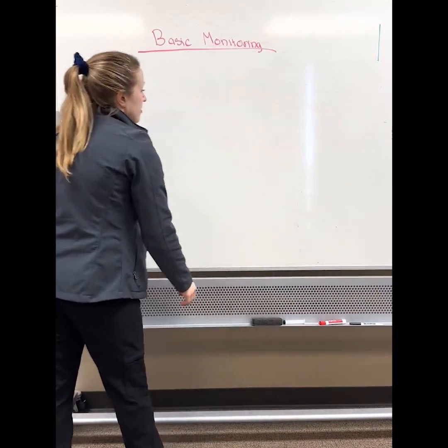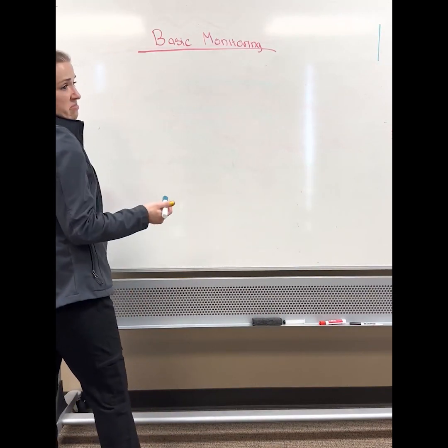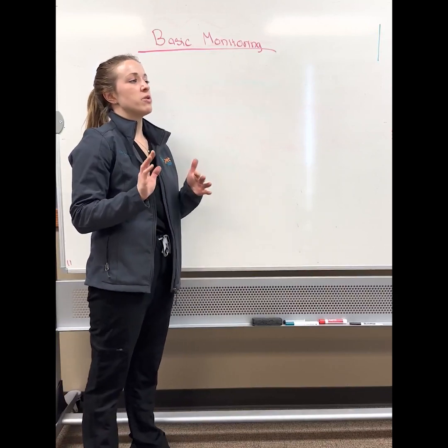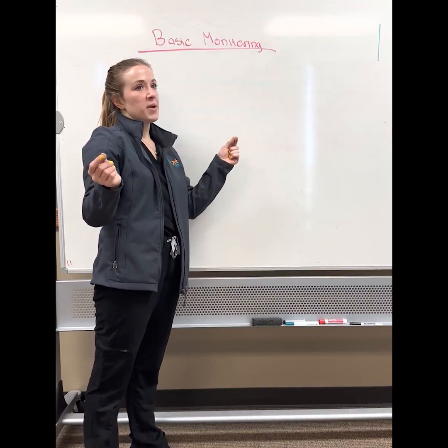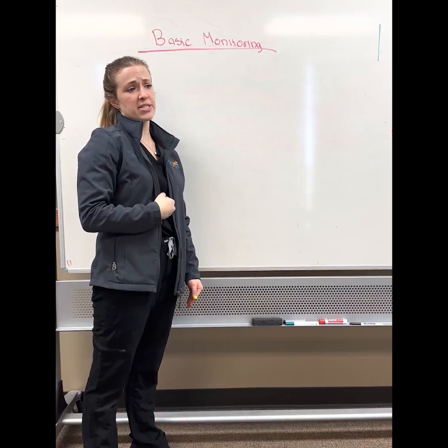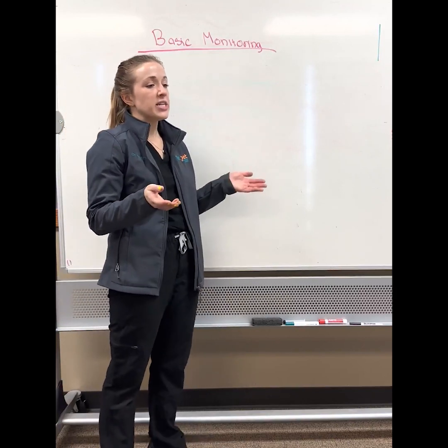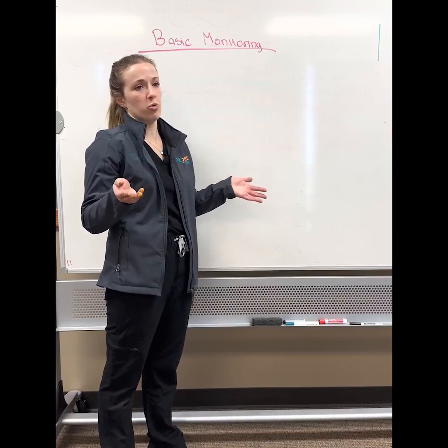Okay, ECG, pulse ox, capnography, two types of blood pressure. Temperature: I don't really have a way to explain how the technology works, but basically you can use either a temperature probe or a digital thermometer. What I do is measure the tubing of the temperature probe down to the top of the rib cage, because that's almost where the stomach is, and I thread it all the way down the patient's esophagus, and I monitor the core temperature. I usually like animals to be around 99 degrees or higher when they're anesthetized, so between 99 and 101 degrees is totally fine.